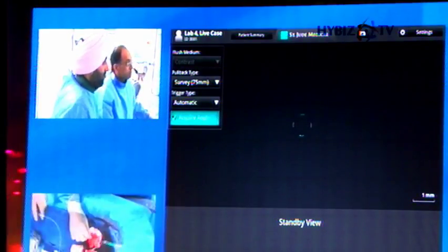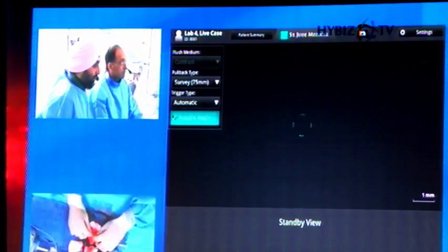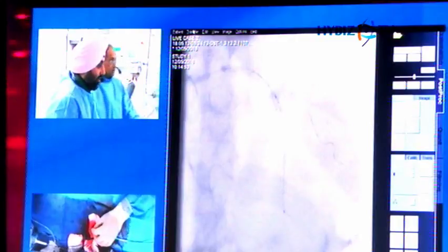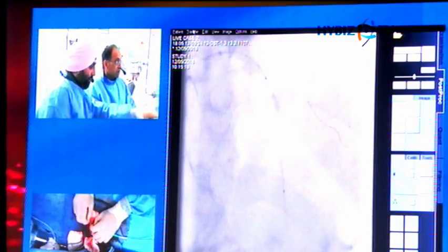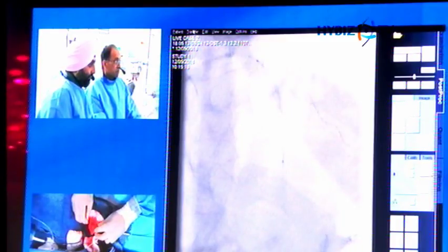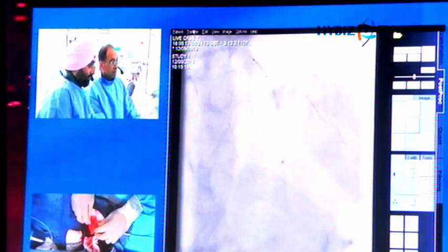Just one second. We can tell on the live view if we're beyond the stent or not. Okay, can we see that? Just come to live view there, please. Okay, so you can come back a little. The length of stenting here will prevent us doing a single run. Yes, please. We can do a single run. There's 75. You come back. We're not within stent. So pull back. That's it. Still not in stent. There we are. So go forward a bit now.